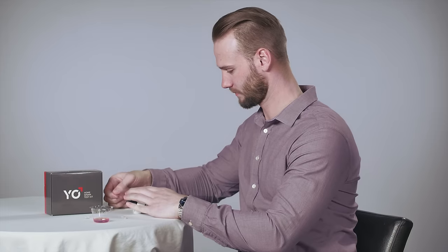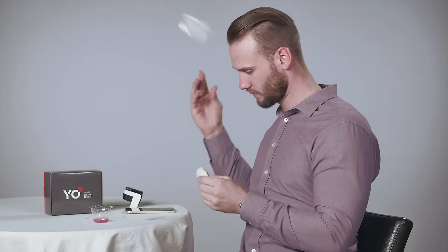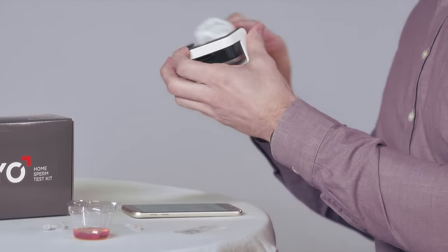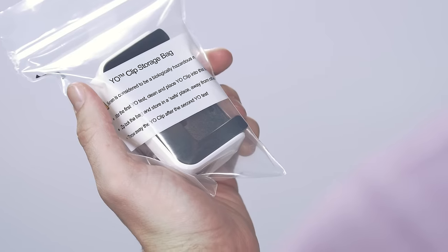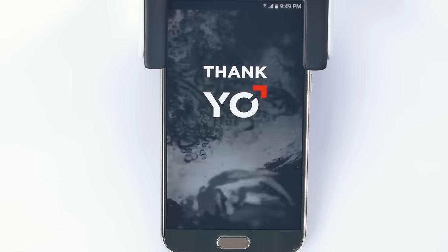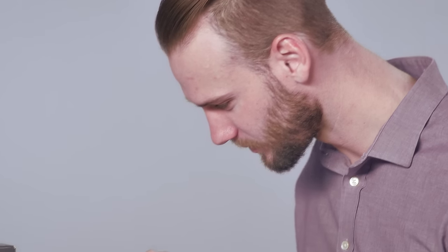The last step is to clean your phone and Yo! clip with the cleaning wipes provided. Store the Yo! clip in the plastic bag included in your Yo! kit. Throw away the used collection cup, powder vial, slide and pipette. Testing is now completed. To view your test results at any time, go to the Yo! archive.